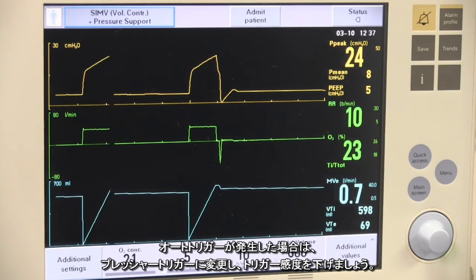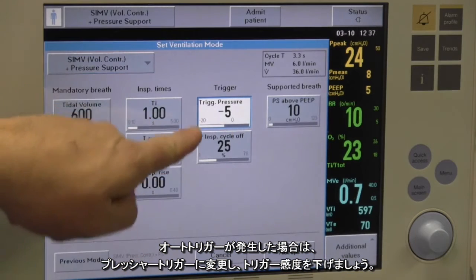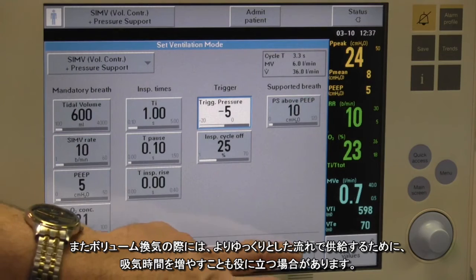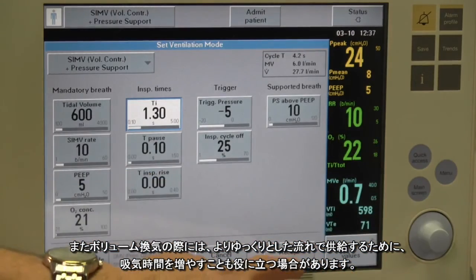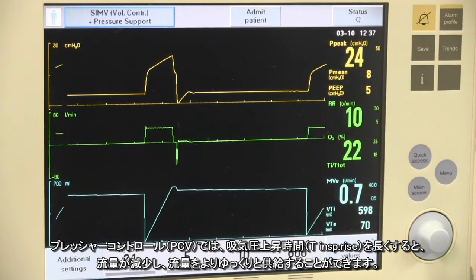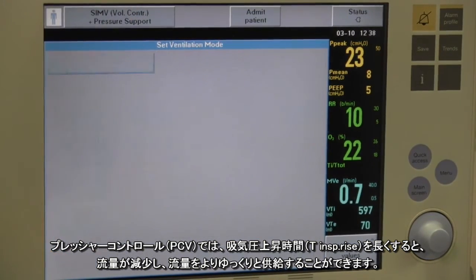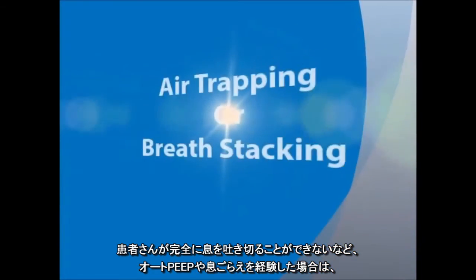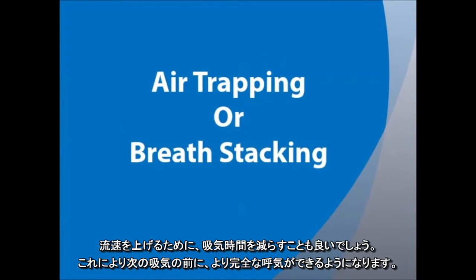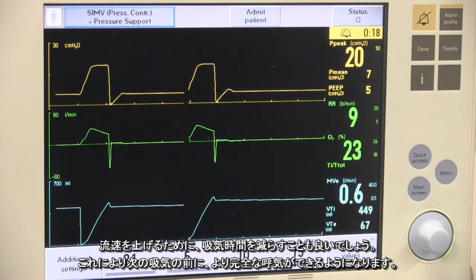If the ventilator auto-triggers, which is also known as auto-cycling, go to pressure triggering and decrease the value to make the ventilator less sensitive. It may also be helpful to increase your inspiratory time in order to deliver the flow more slowly in volume ventilation. In pressure control ventilation, increasing T inspiratory rise will decrease the flow rate and also allow for flow to be delivered more slowly. In the event of air trapping or breath stacking, such that your patient is unable to fully exhale, it may be helpful to decrease the inspiratory time in order to deliver the flow more quickly. This will allow for more complete exhalation prior to the next inspiration.